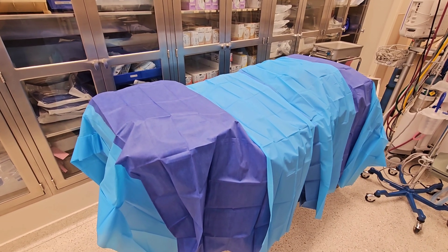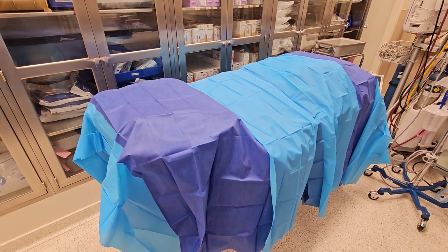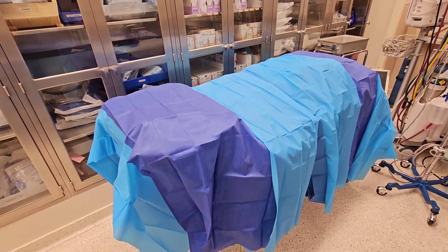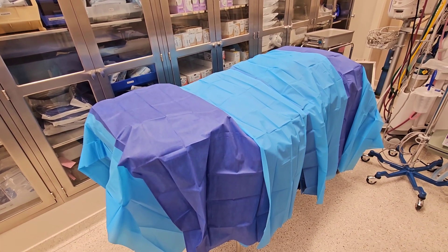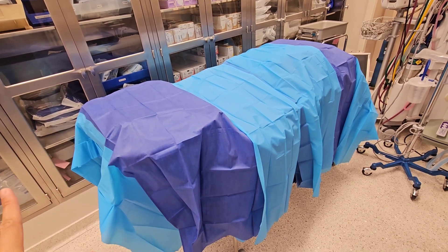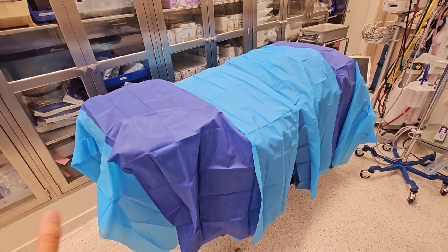All right guys, remember when I said 'when in Rome, you do it like how the Romans do it.' Not necessarily what I would do because in my other facility they have a Z drape, which is made for this, but this hospital does not have that and this is what they resort to. I'm just following what they're telling me to do, so this is the proper way to actually do it.